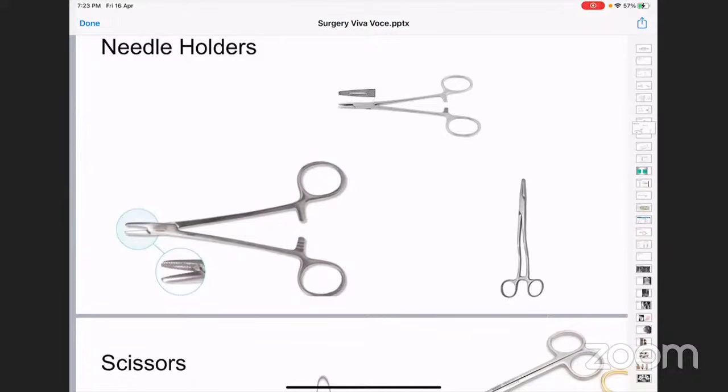Very good. And actually, this point where you grip the needle can be adjusted when you want better leverage. If you want better leverage, you can hold it relatively closer to the tip. If you want better swing with your wrist, you can hold it away from the tip. So as Anushka rightly said, you hold it at the junction of the proximal 2/3 and the distal 1/3, and you can adjust that slightly depending on whether you want more leverage or better swing with the wrist.